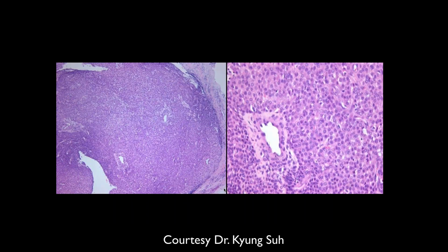It looks like, I'm not sure, it's like a muscle. There's a lot of blue cells. So I'm guessing it's probably malignant. Oh, glomus tumor. This turned out to be a rare location for another glomus tumor.